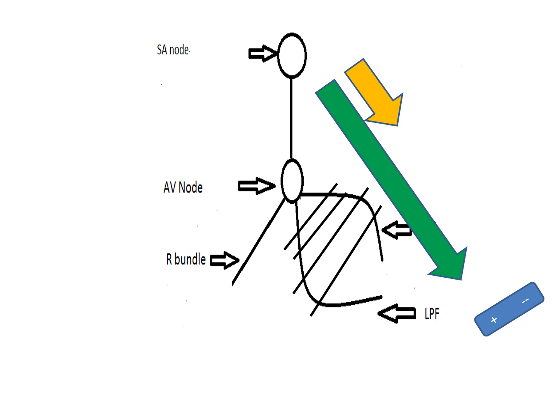Depolarization is increasing positive charge, repolarization is increasing negative charge. What that means is that electrodes, which are set to go positive when there is more positive charge going towards them, and to go negative when there is negative charge going towards them, are going to show the QRS and the ST segment pointing in the opposite direction, or discordance.